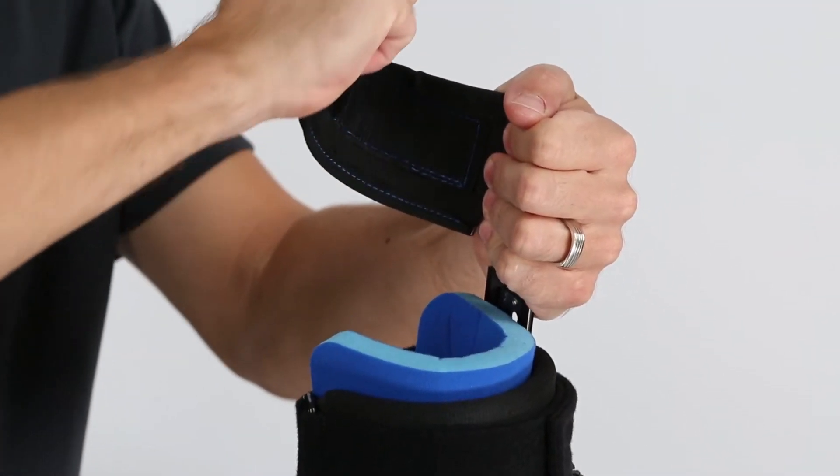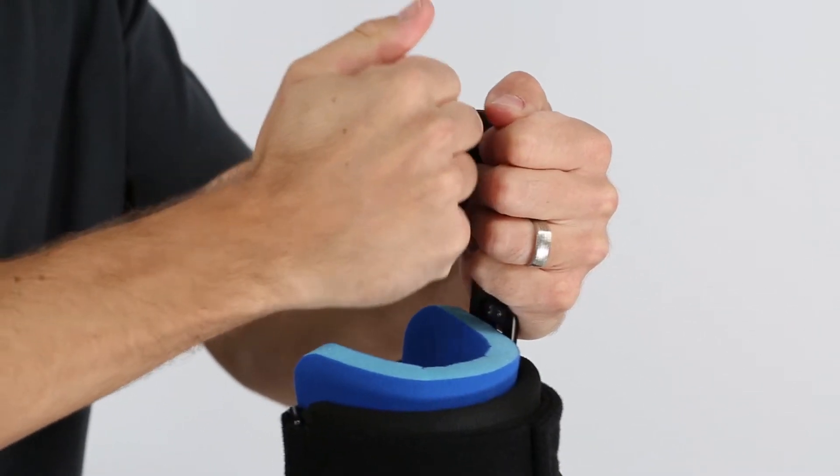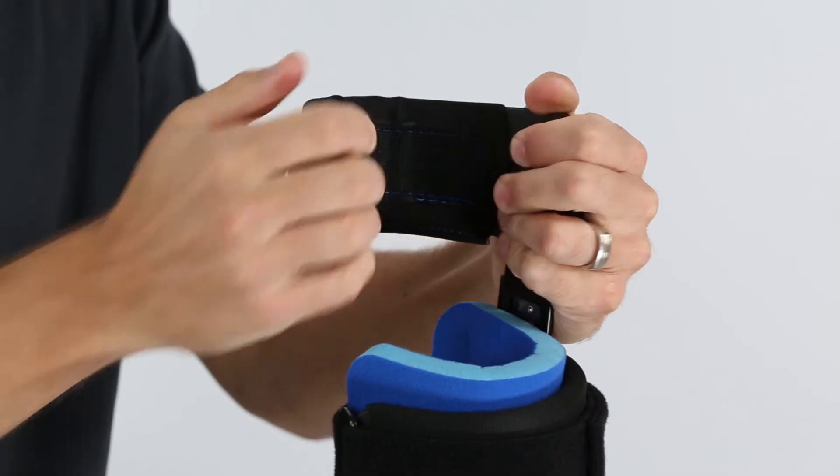Advance's unique contour cuffs are made of an aluminum insert and rubberized coating that enable you to bend and twist the cuffs easily.